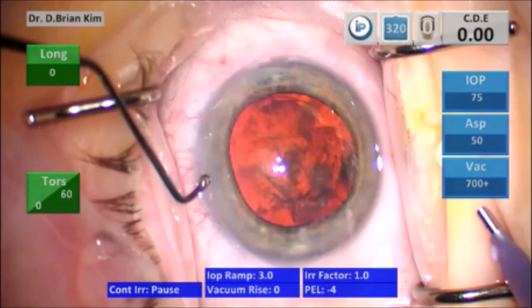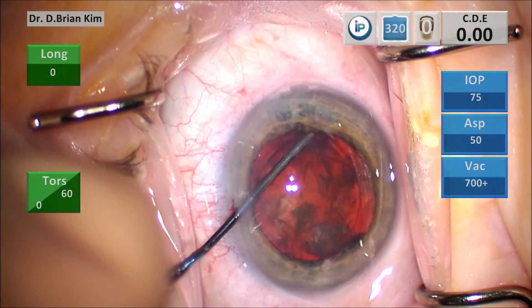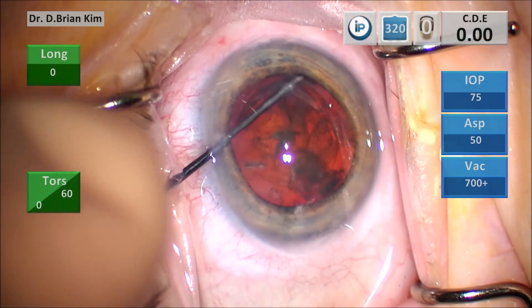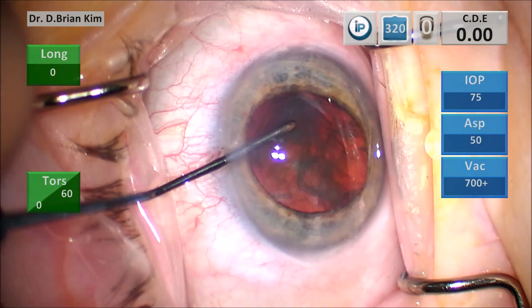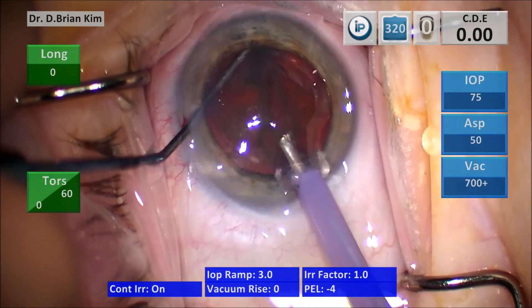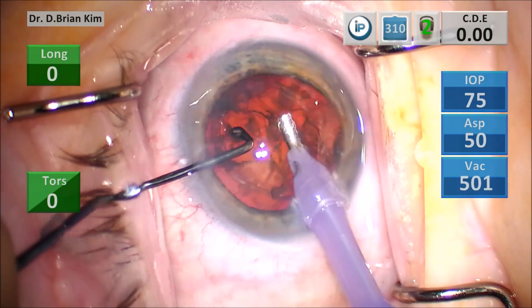In another example, I'm in the pronated position going into the eye, sliding under the epinuclear material, rotating my hand. I nudge the lens just to prove that I am indeed in the equator — when I do that maneuver, the lens jiggles and moves within the horizontal plane. If I'm on top of the lens and I try to supinate my hand, all it does is cause the lens to tiddlywink and it doesn't actually move horizontally.